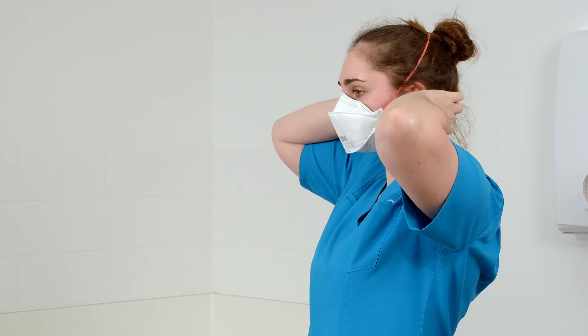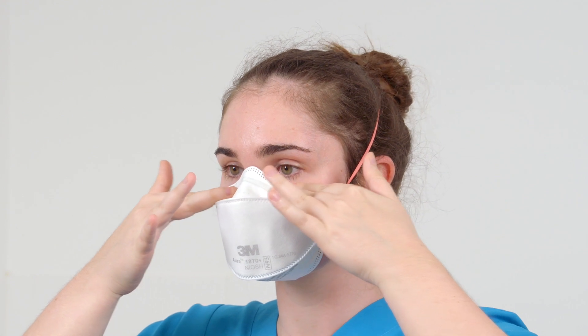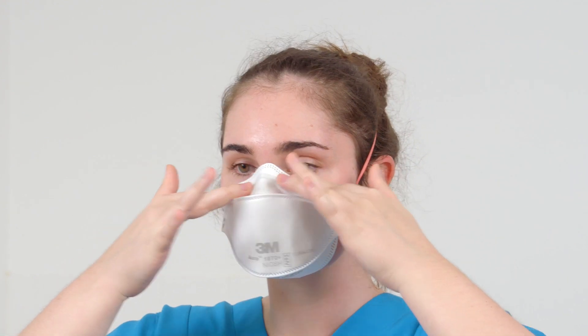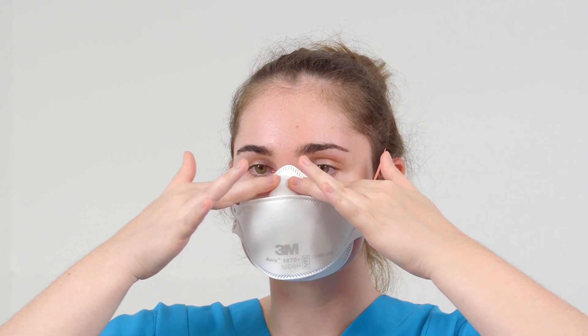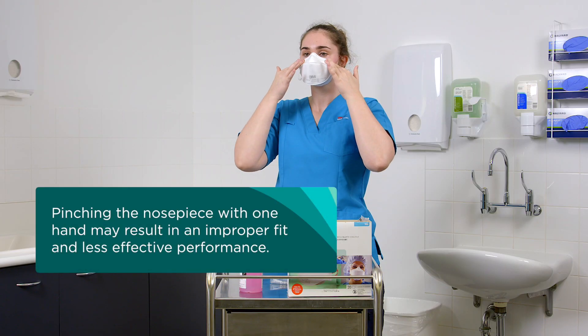Place your fingertips from both hands at the top of the metal nose piece. Using two hands, mould the nose area to the shape of your nose by pushing inward while moving your fingertips down both sides of the nose piece. Always use two hands when moulding the nose piece. Pinching the nose piece with one hand may result in an improper fit and less effective performance.